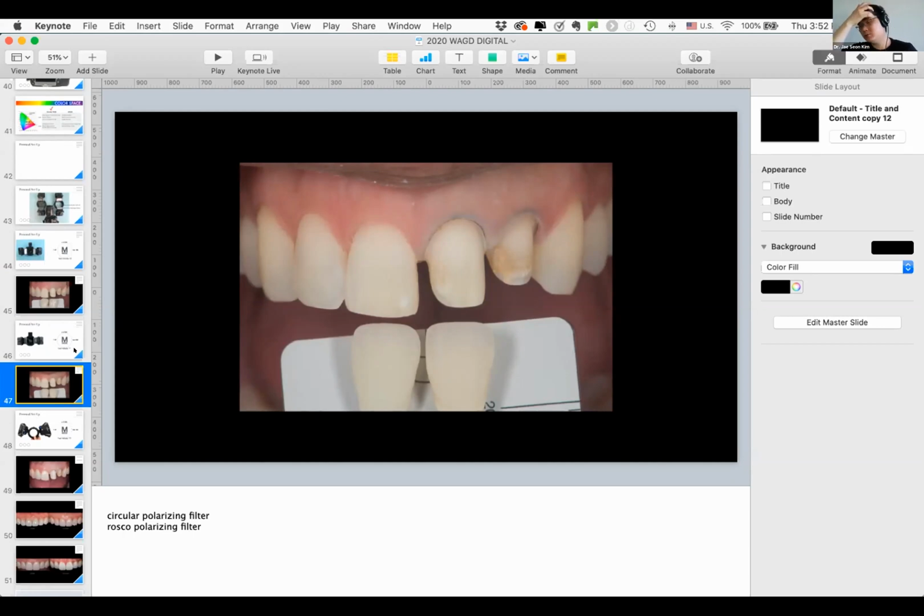Actually, one way is when you place an occlusal mirror in the patient's mouth, rather than just putting the mirror edge on the distal of, let's say, number 2 and pivoting the mirror, because the patient has to open a lot, I actually drop the mirror down and have the mirror almost touch the mandibular molars, and then have the patient open and take the picture. So you get more distance, and you'll actually get a better photo of the second molar.